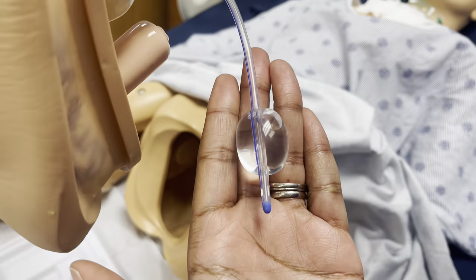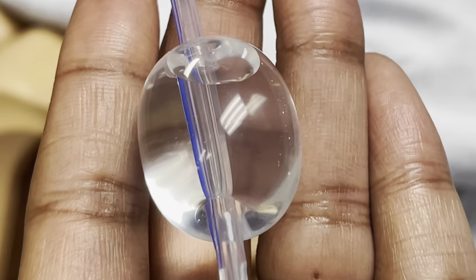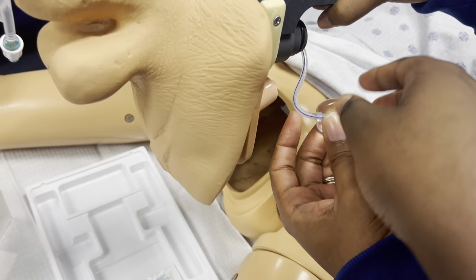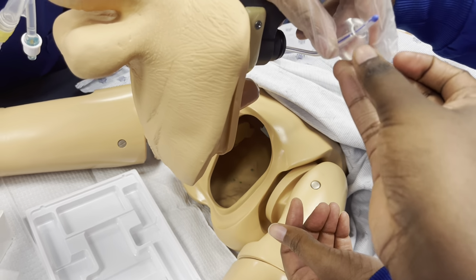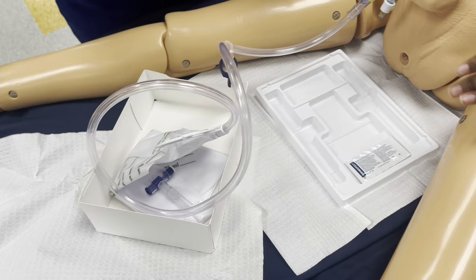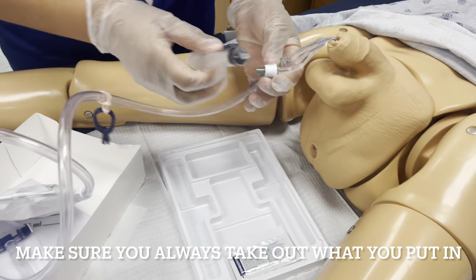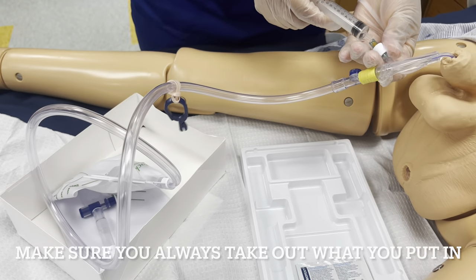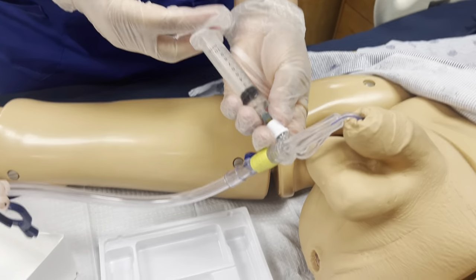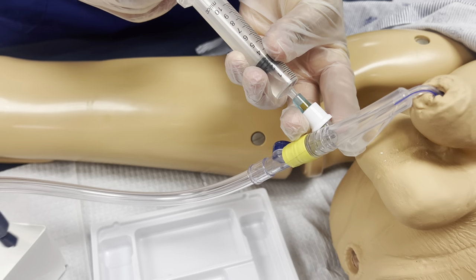Okay, now put all this stuff there. I'm going to take it. This is how it looks in the bed when you insert all of the fluid. How does it feel? Let me see, because we're just over here examining. It's like a bubble. Okay, now I want to take the fluid out, y'all, for my vlog. Let's listen in and look at it. Deflate. Take all the liquid out. Reverse. Let's go.